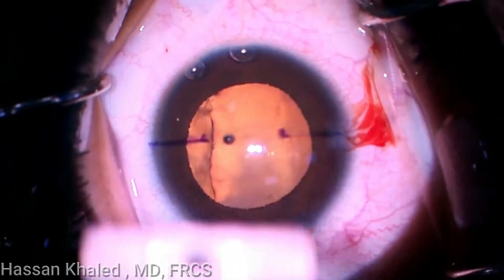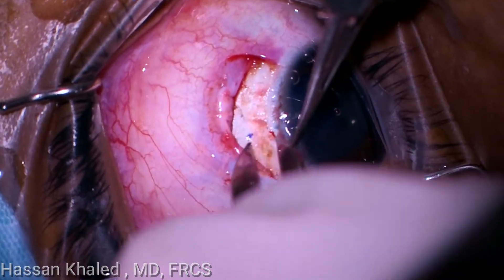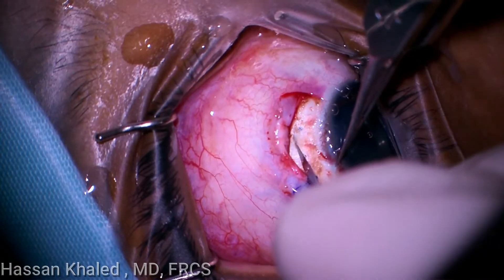After marking the point opposite to the maximal subluxation, conjunctival peritomy with scleral pocket creation 2 mm from the surgical limbus was done, as is clear.